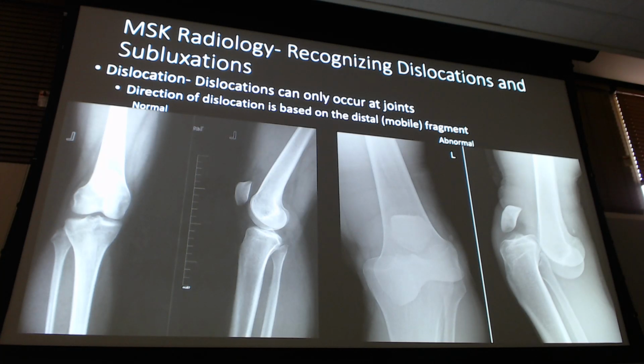Recognizing dislocations and subluxations. Over here on the far right, is this dislocated or subluxated? So, dislocated.